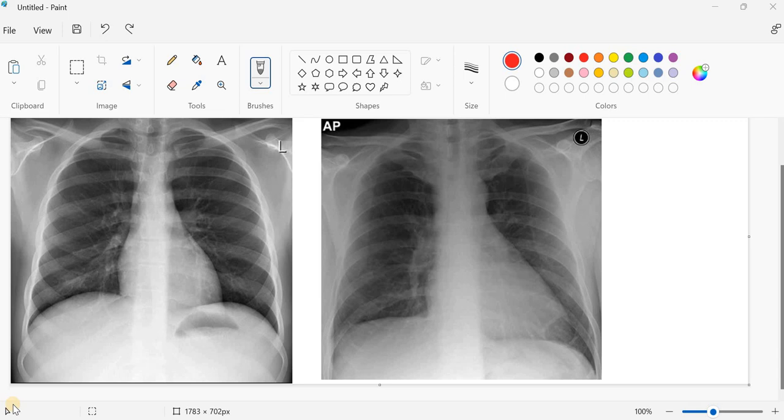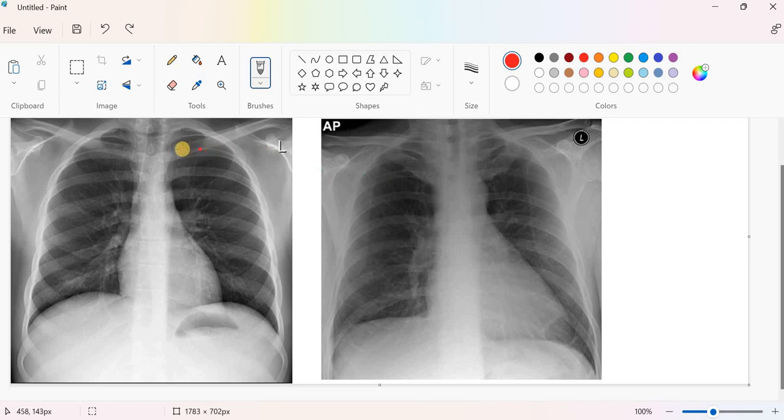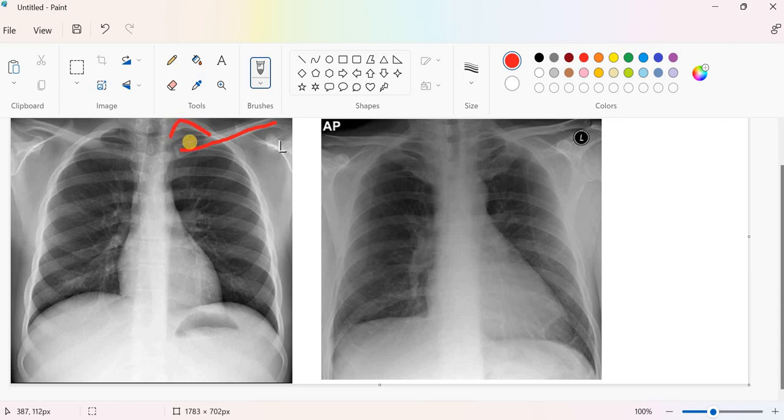First of all, we will look at the clavicle. The clavicle in case of posterior anterior view of the chest X-ray is usually appearing a bit below the apex. So this is our clavicle and the apex of the lung is just above it. There is a space here, there is a distance.